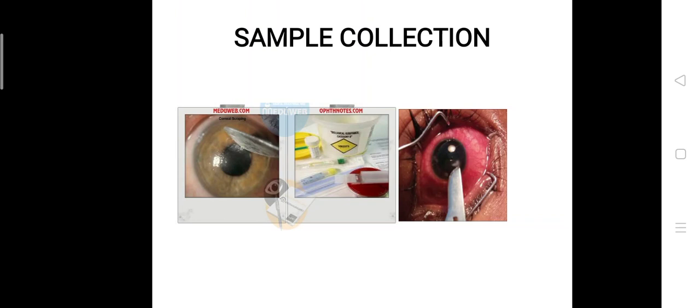A platinum spatula can be beneficial, as it can be heat sterilized between specimens and cools quickly. Then you have to label the plates, vials, and slides with information identifying the patient and the location cultured. It should also be tallied with the request form and the report form.